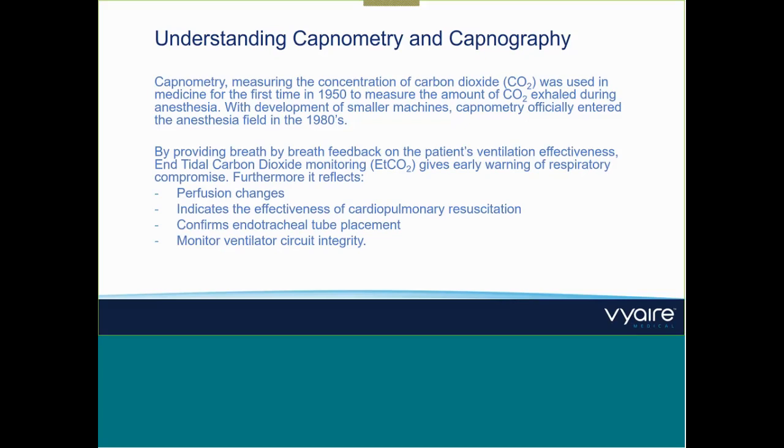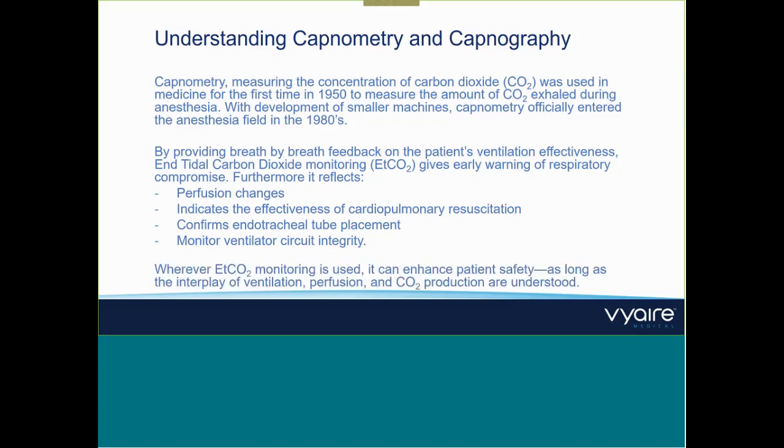And also, maybe not the most important, you can check the ventilator circuit integrity, because when things are going on which are not correct, you will also see this on the capnography. But whatever you do in ventilation, it's easy, it doesn't hurt anyone, it's good to understand, but of course in the end you need to know what you're doing and how to interpret basic waveforms.